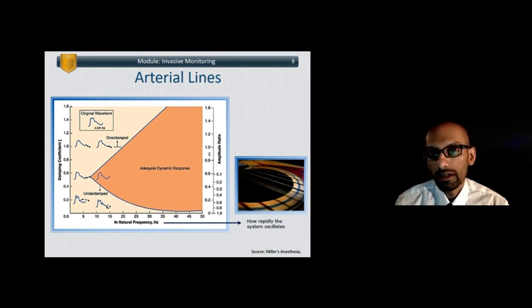That's one beat for every second, and since one beat per second is the same as one cycle per second, that's 1 hertz. If your heart rate is 120 and you're tachycardic, that's 2 heartbeats per second, that's 2 hertz. So that's the most obvious example in a biologic system, in a human being, in a patient, of how we produce a fundamental frequency.